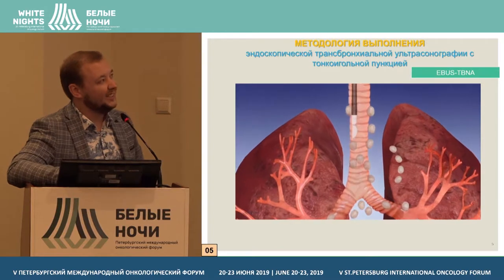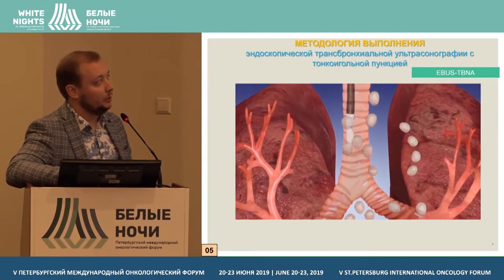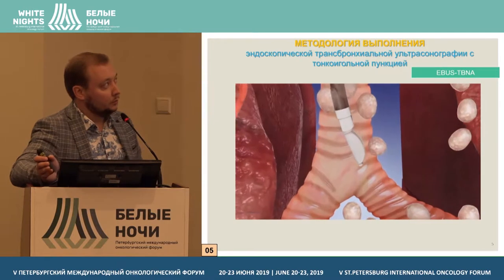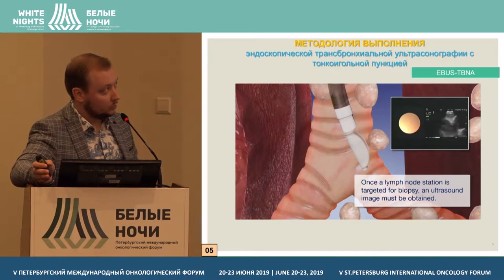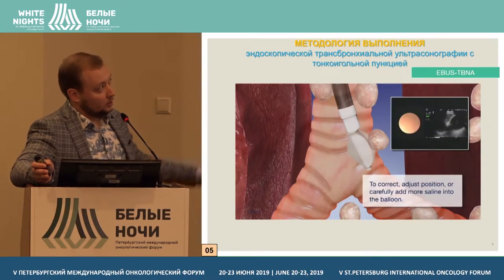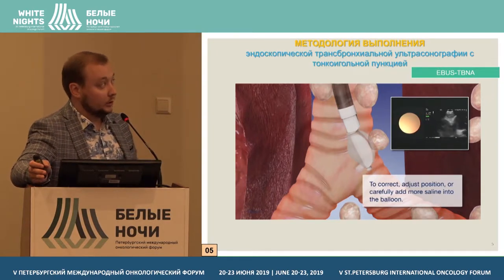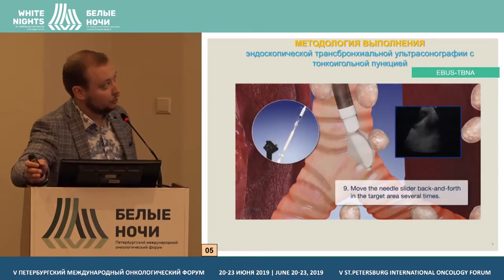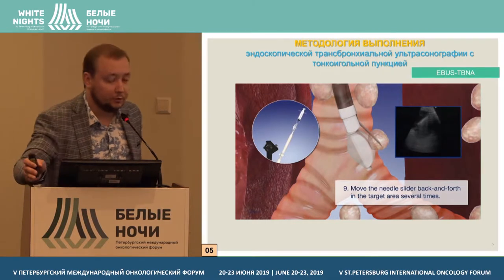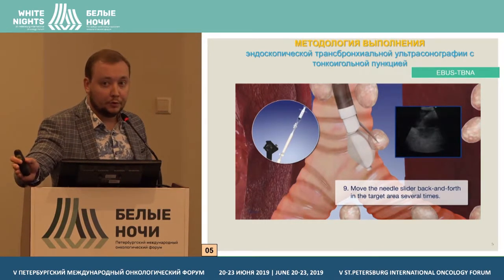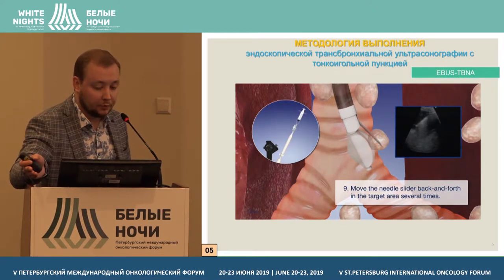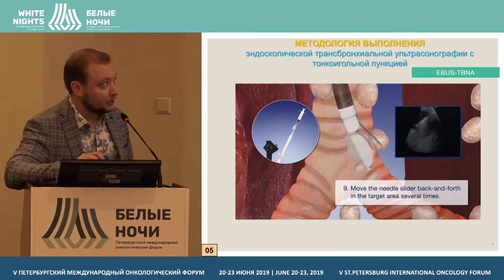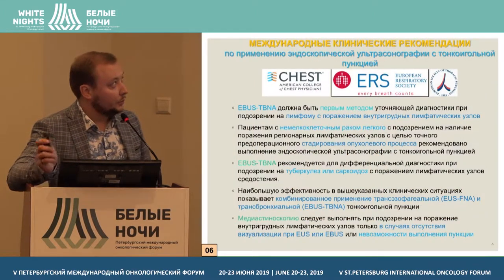This is a small video about the technique in the case of the tracheobronchial tree. We visualize the area of interest, then we inflate the balloon to stabilize and prepare the surrounding tissue. This procedure can be used both with IV sedation and without it.